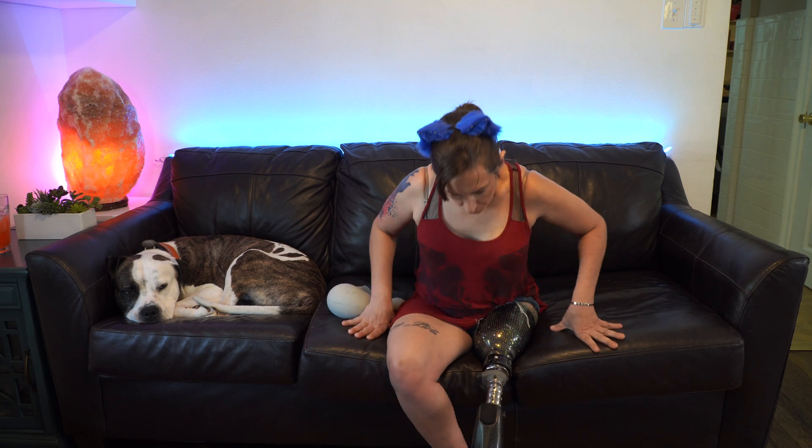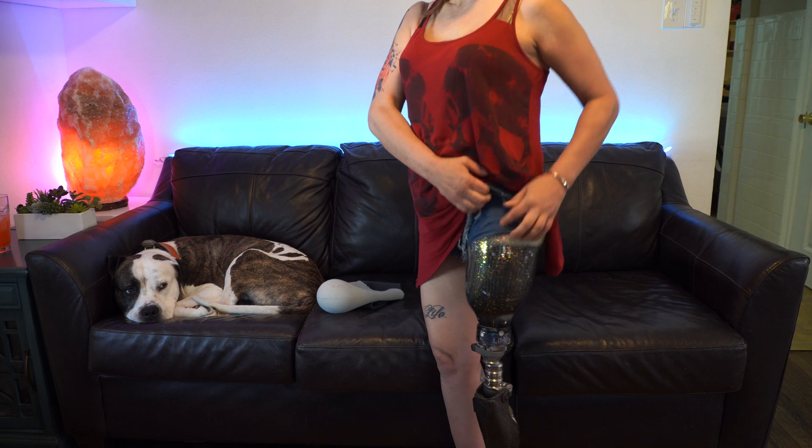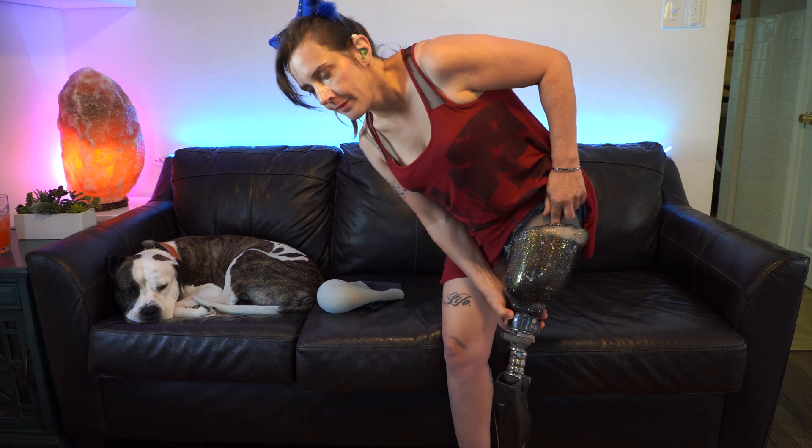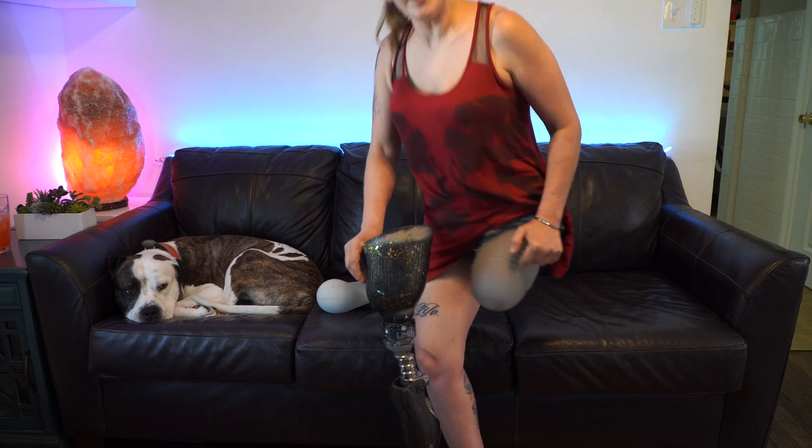My prosthetic leg has a vacuum system. Right here is the vacuum pump, and then the liner has these little fins on it. The vacuum pump, when it turns on, sucks the air out of my socket and it keeps my leg on. When I first got this definitive prosthetic socket, I was using a slightly different system — still the vacuum system, but a different liner and sleeve combo.